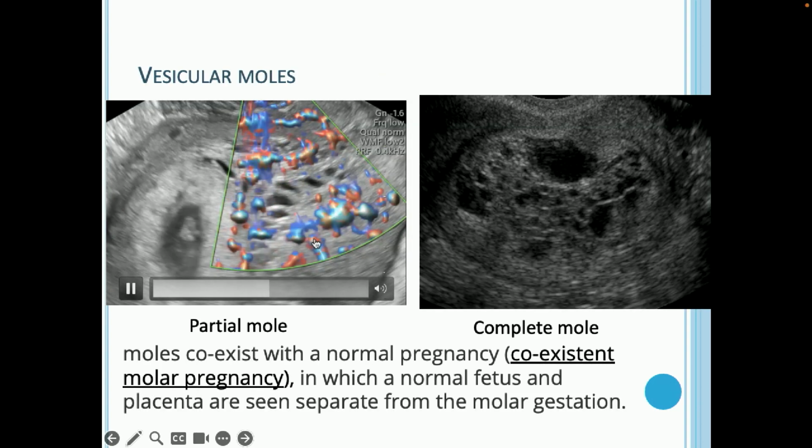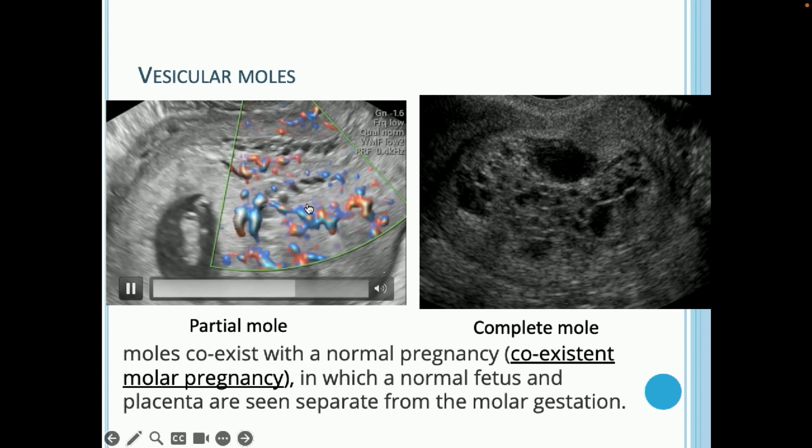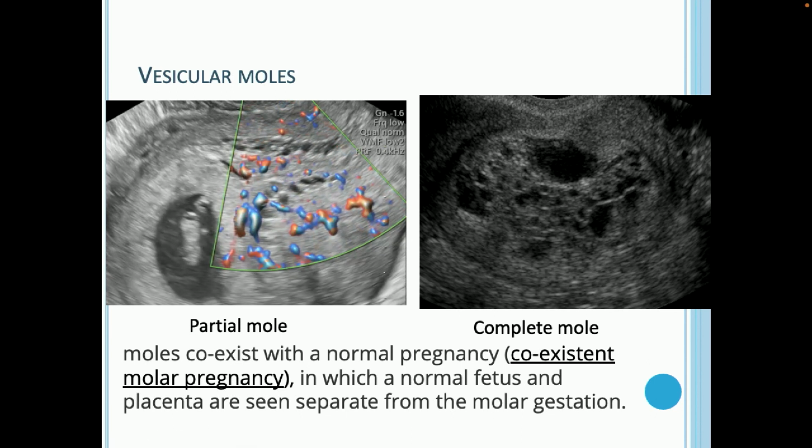correctly, because the fetus is there and it is normal, and the placental tissue shows a little more thickness and a little more anechoic areas. That makes the diagnosis quite difficult. Whereas complete mole, we know, usually shows very clearly thickened endometrium, multiple anechoic areas, a bunch of grapes-like appearance, and if it develops to a larger size, it may show a lot of vascularity.